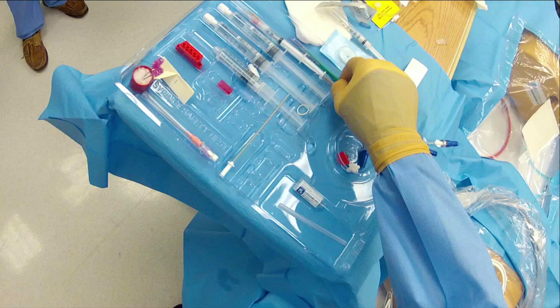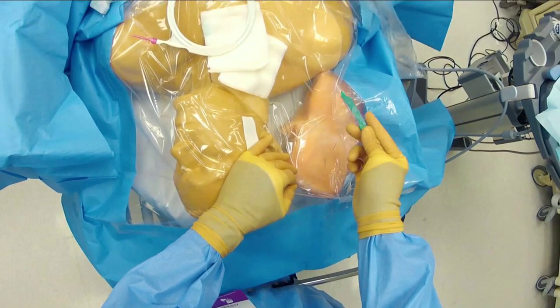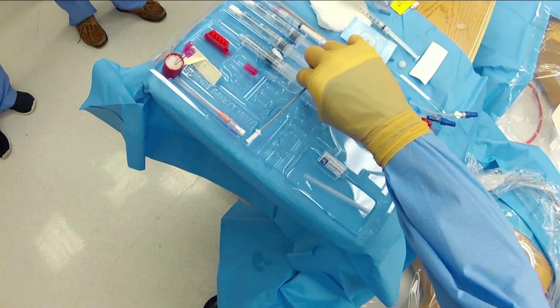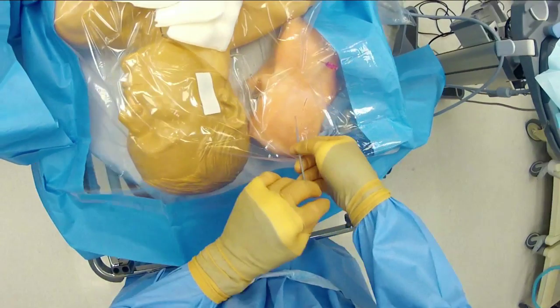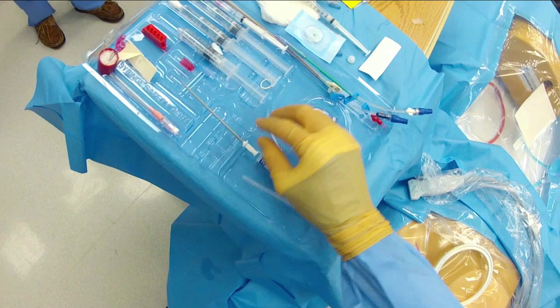With the wire confirmed in position, we take the 11 blade and puncture the skin to make a small nick so everything can fit through. We keep our hand on the wire at all times. The next step is taking the soft tissue dilator and threading it over the wire. We advance it through the soft tissue, holding low to the skin and using a twisting motion, advancing it less than the needle was advanced — dilating the soft tissue only and not the vessel wall itself.